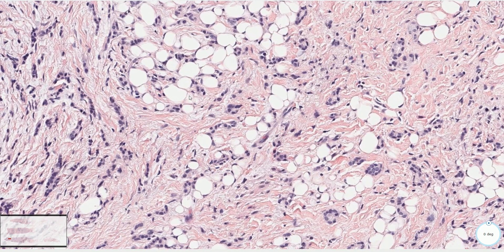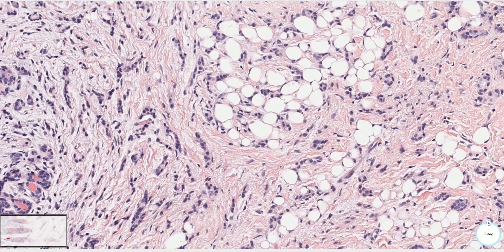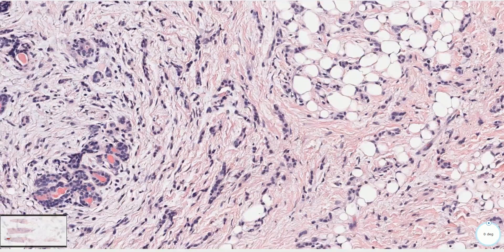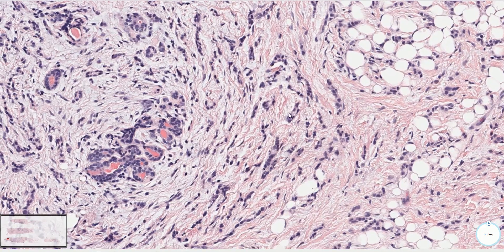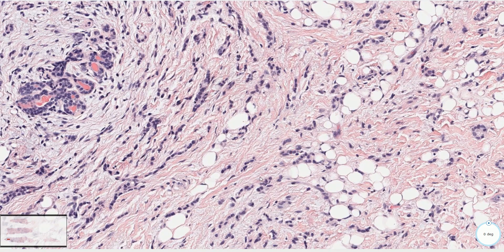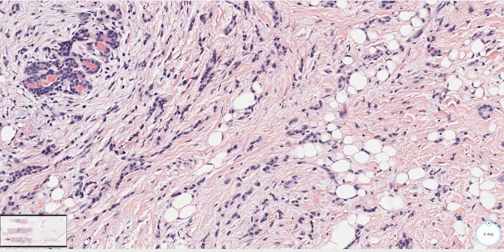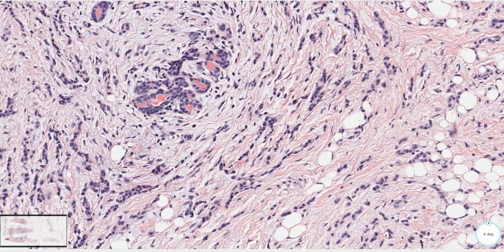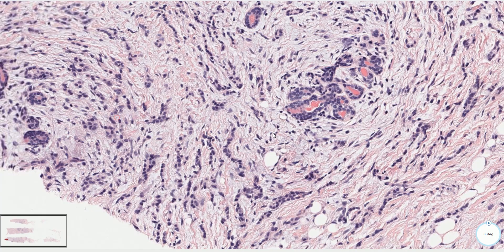It expresses hormonal receptors — estrogen receptors and progesterone receptors — and HER2 is typically negative. Both components are positive for E-cadherin, unlike lobular carcinoma which is also a differential diagnosis.